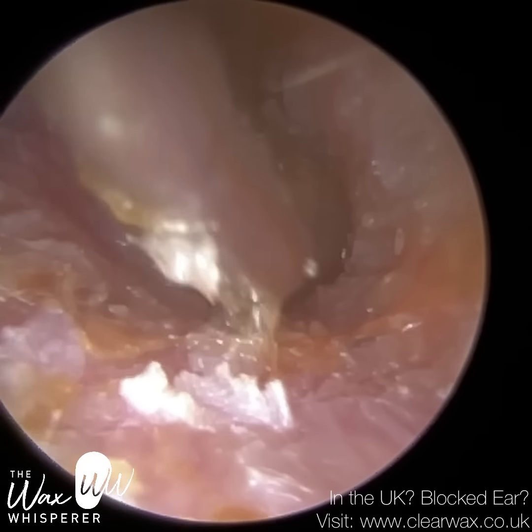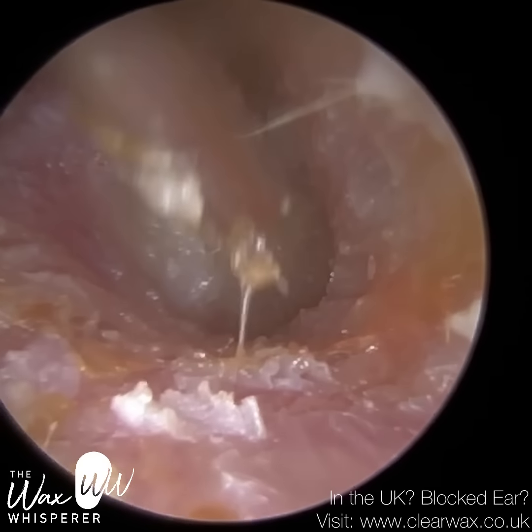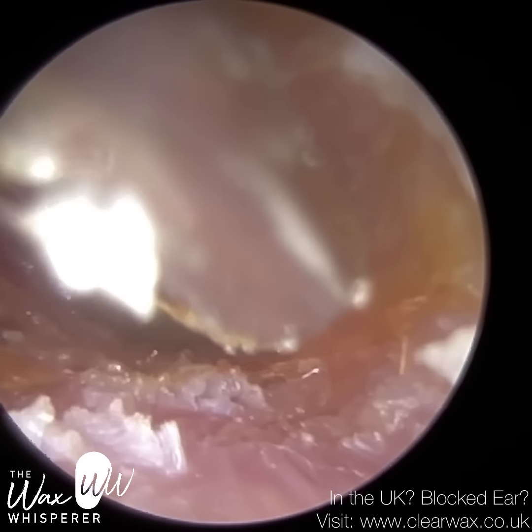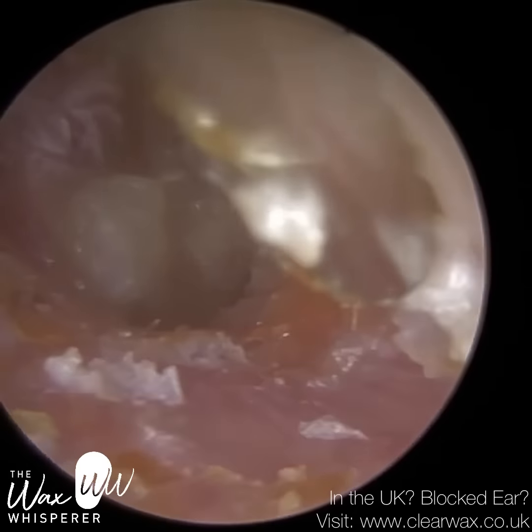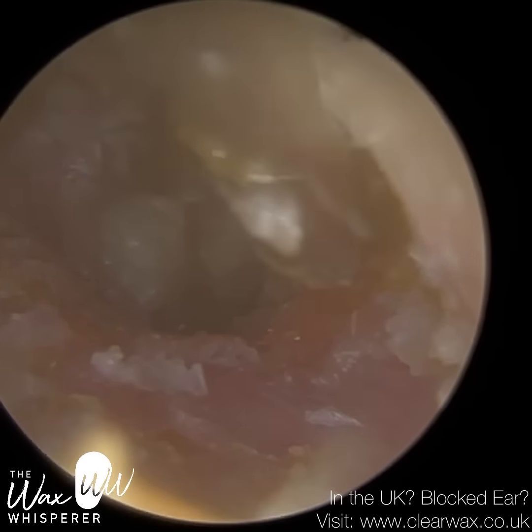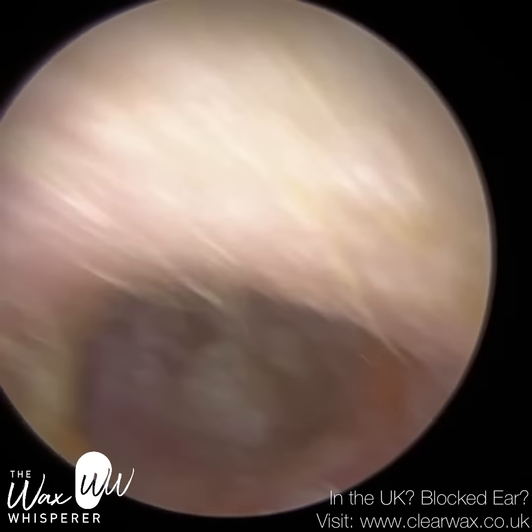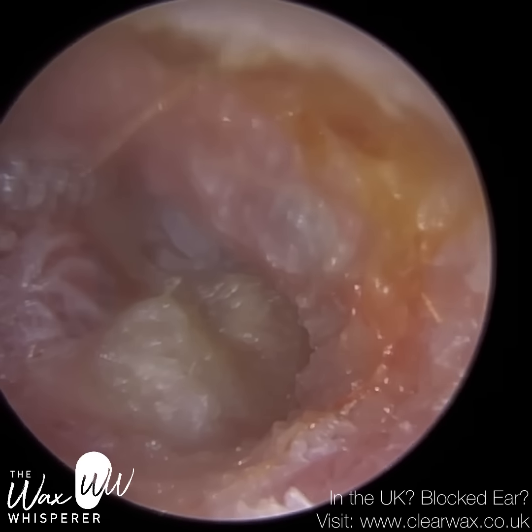You probably just saw it there momentarily, but we continue, and I think it's once more just there. You could see that they just moved and just coughed, but it was very short-lived, and I was able to still continue in the ear, truth be told. So I'm just trying to get some of this debris out of the ear near the canal.